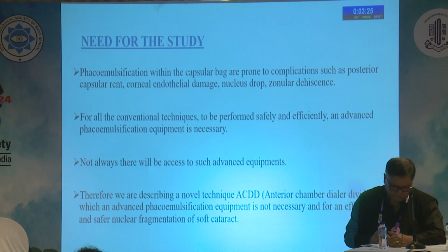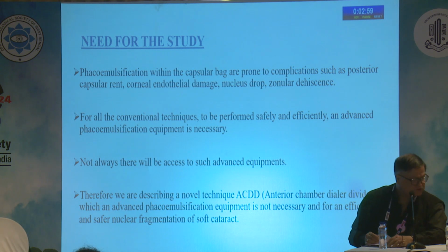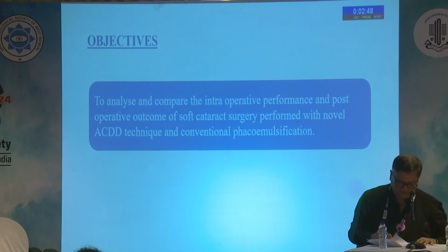Phaco within the capsular bag is prone to complications such as PCR, corneal endothelial damage, nucleus drop, and zonular dehiscence. For all these conventional techniques to be performed safely and efficiently, advanced phacoemulsification equipment is necessary, and not always will there be access to such equipment. Therefore, we are describing a novel technique, anterior chamber dialer divide, for which advanced phacoemulsification equipment is not necessary, and which allows efficient and safer nuclear fragmentation of soft cataract. The objective of this study was to analyze and compare the intraoperative performance and postoperative outcome of soft cataract surgery performed with the ACDD technique and conventional phaco.